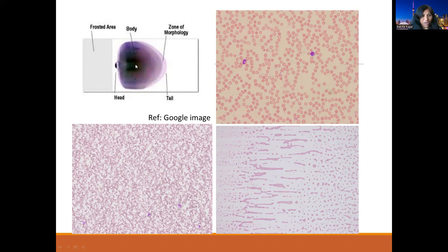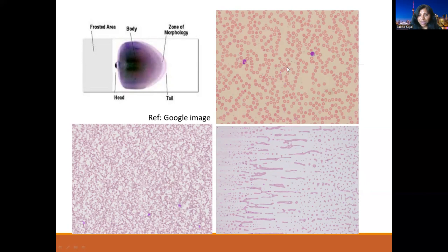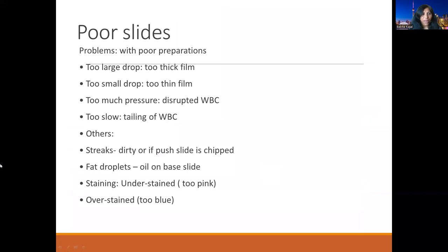This is a nicely made blood film. The drop of blood is placed here and the spreader slide is used to make the film. The thickest part at the beginning should not be used for morphology, as the RBCs there are overlapping. The monolayer area — where RBCs are barely touching each other and not overlapping — is where you assess morphology. In the background you can see erythrocytes and small platelets scattered singly.